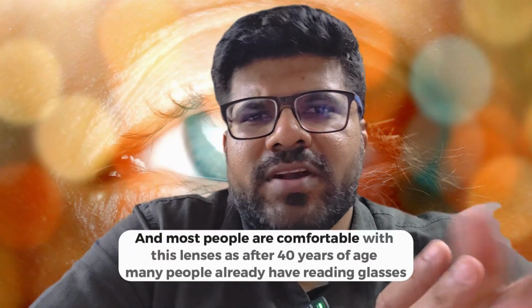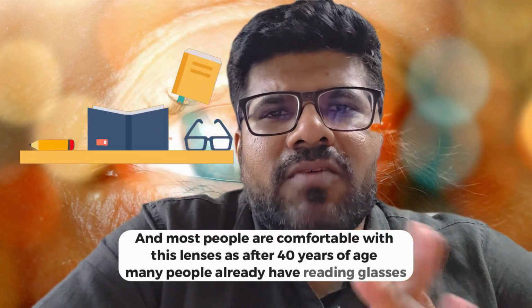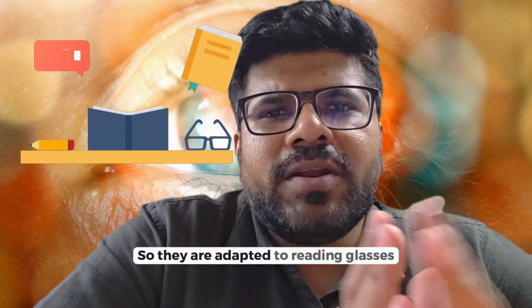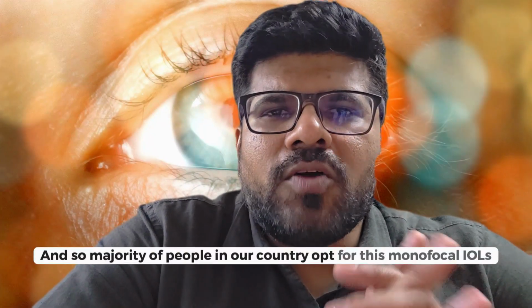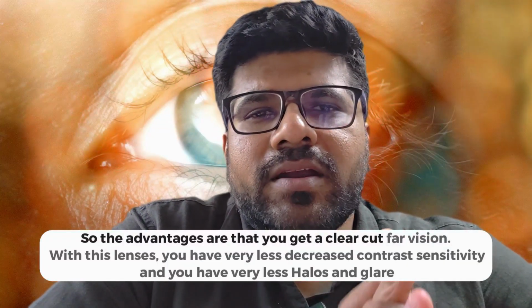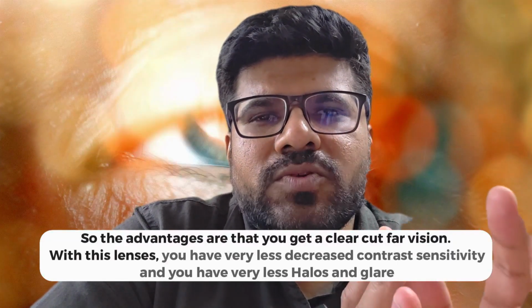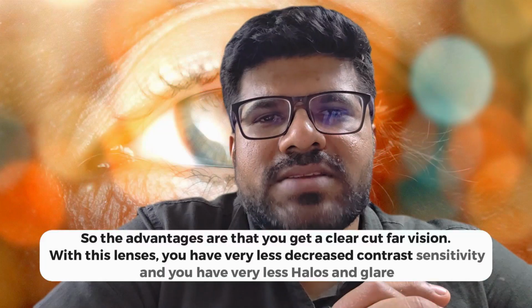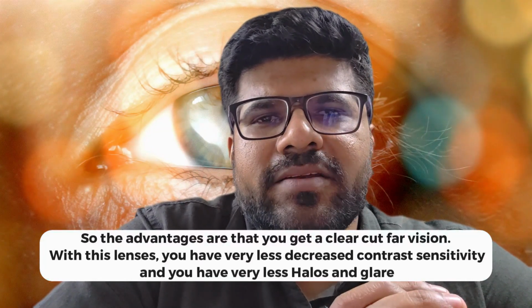And most people are comfortable with these lenses, as after 40 years of age, many people already have reading glasses. So they are adapted to reading glasses. And so the majority of people in our country opt for these monofocal IOLs. So the advantages are that you get a clear-cut far vision. With these lenses, you have very little decreased contrast sensitivity, and you have very few halos and glare.